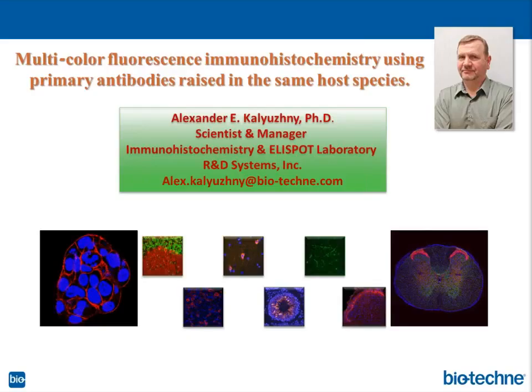First, we incubate the tissue with the unmodified primary antibody, and then instead of going with its secondary antibody, we incubate the tissue with the anti-DIG labeled secondary antibody. And in this case, you're not expecting to see any signal, any staining. That's going to be a good negative control.